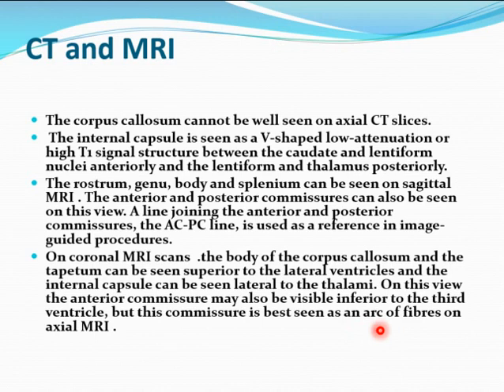The white matter on T1 appears as what? Hyper or hypo? Hyper. So the internal capsule is white or gray matter? White. So it appears as what on T1? Hyper. Why is it hyper on T1? Because it contains fat.